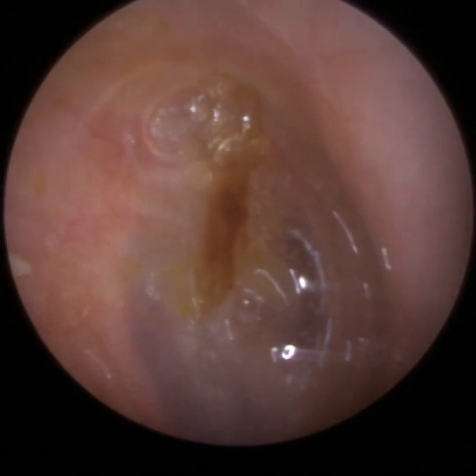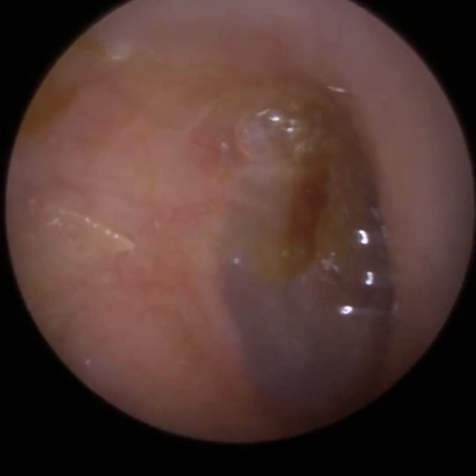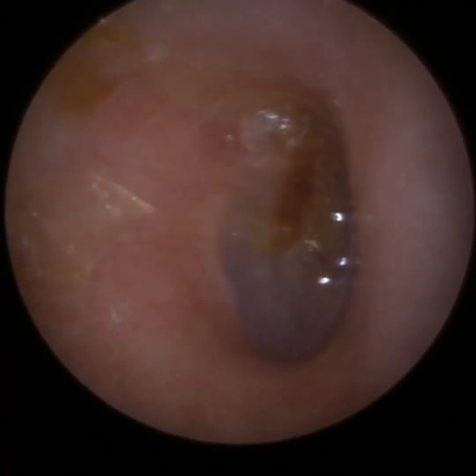The hammer, that's when the patient suddenly moves. You just saw that, and I quickly just got out of the ear, so we don't want to cause any injury or trauma. So I'm just going to, I'm happy with that. We've got the majority of the skin.